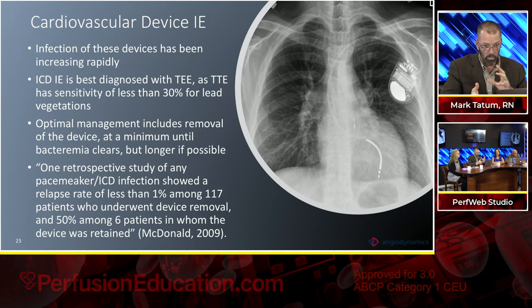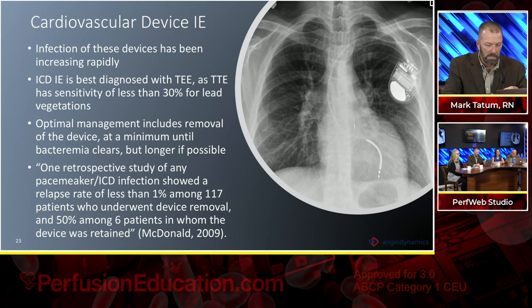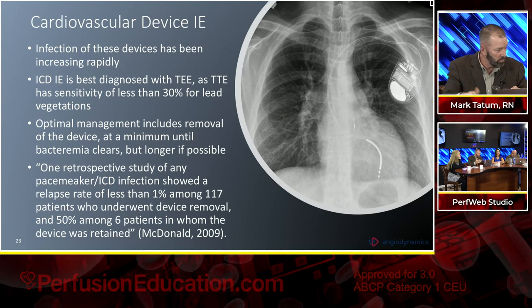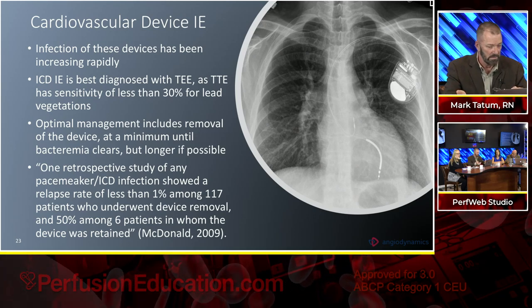Yes, pull and pray is one thing. When you talk with interventional radiology, they'll tell you that the lungs are the world's greatest filter. I've heard that more times than I care to count, but to a certain degree, it's the God's honest truth. If you have normal PA pressures, et cetera, you can send something to the lungs. It'll either dissolve or the patient will do fine.